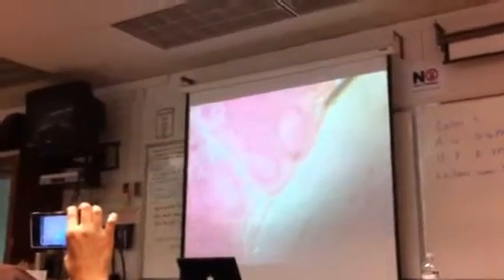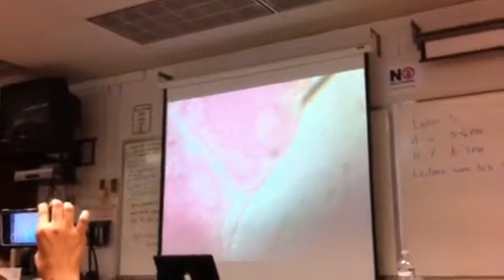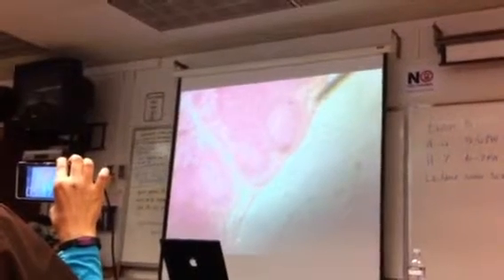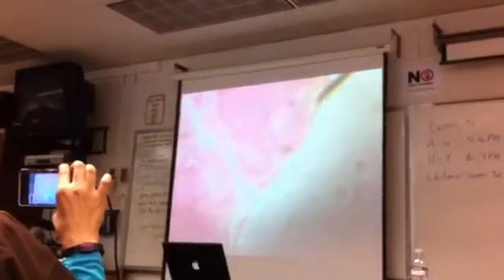Anyway, pretend that you can see there's some round structures that drive me crazy. Here and here and here. Those are those things called the germinal centers. I think they're also called lymphatic nodules. That's the area right along the border of the lymph node where all the stuff initially filters into the afferent vessel. You can also see, remember I said there are little fingers that go in. It's called the trabeculae, the little fingers in the capsule that separate the lymph node into compartments. Here, while it's behaving, you can see some of the lymphatic nodules there.